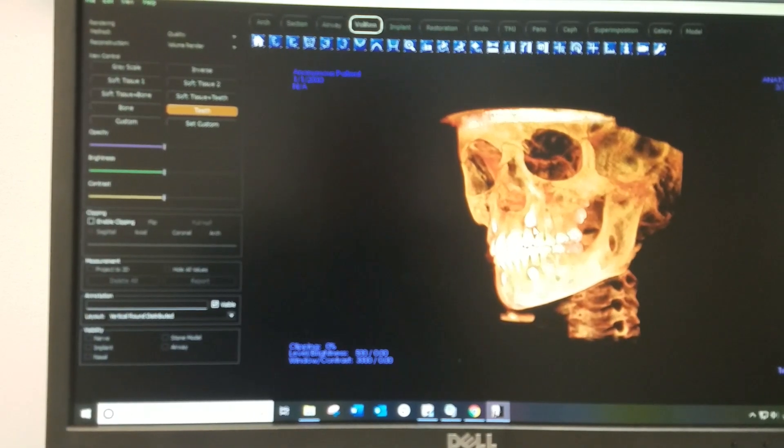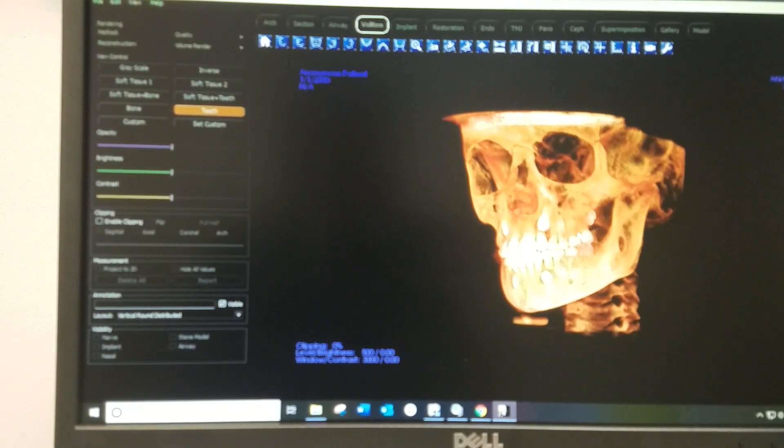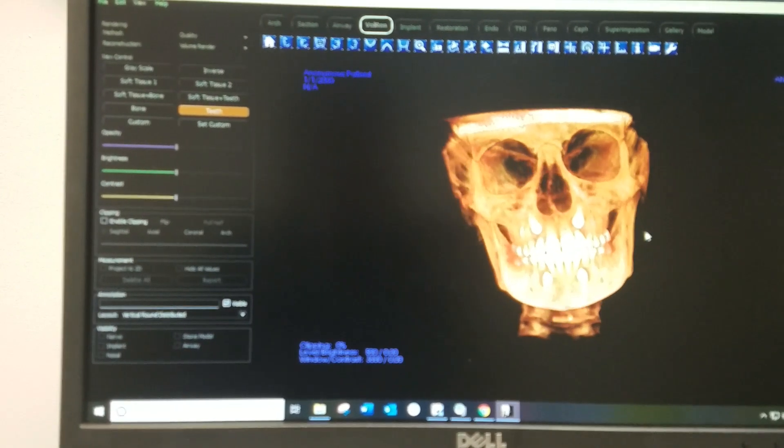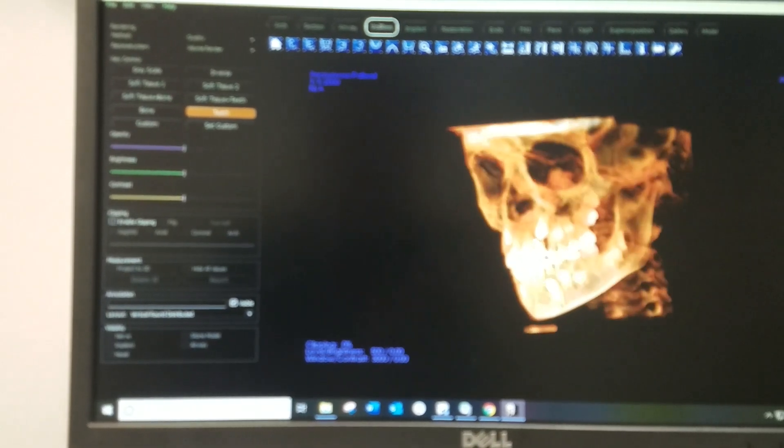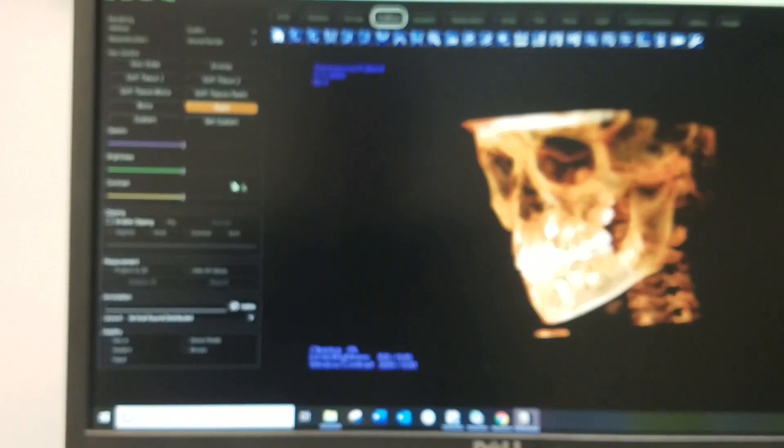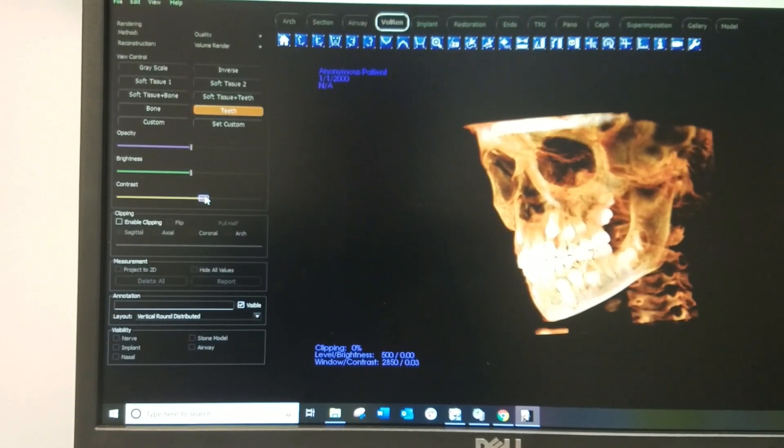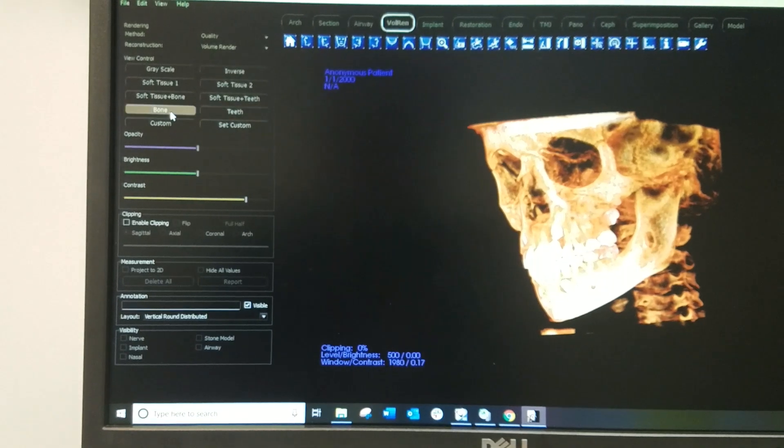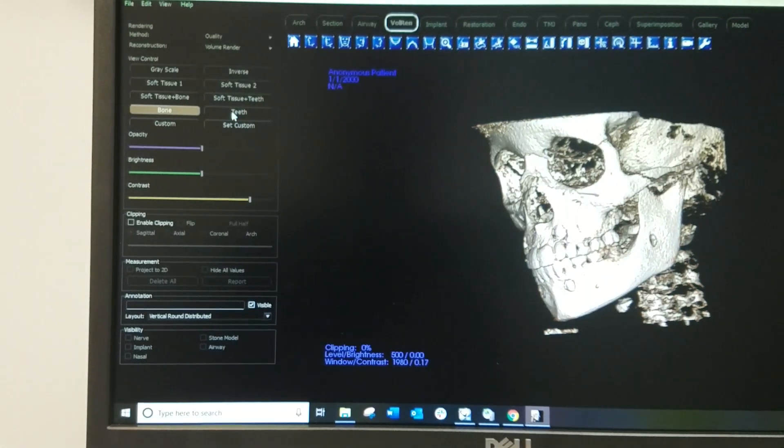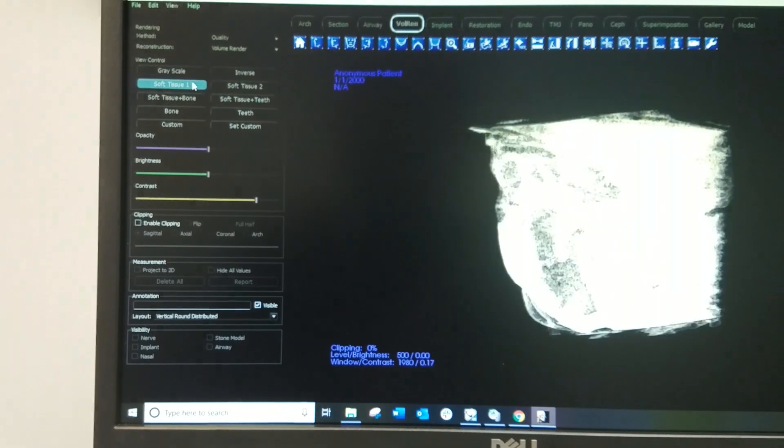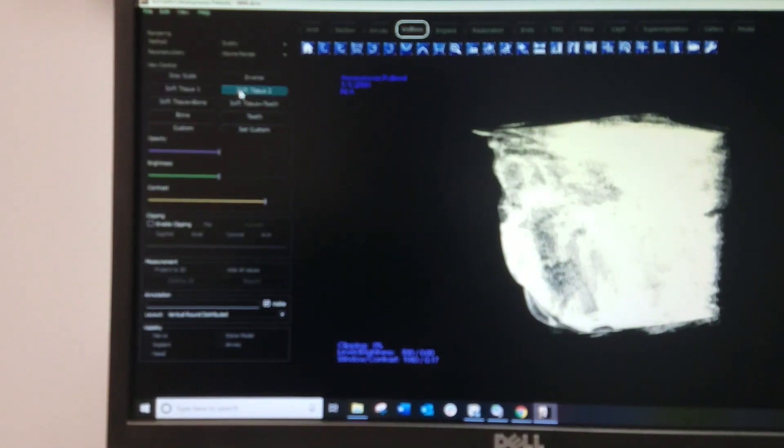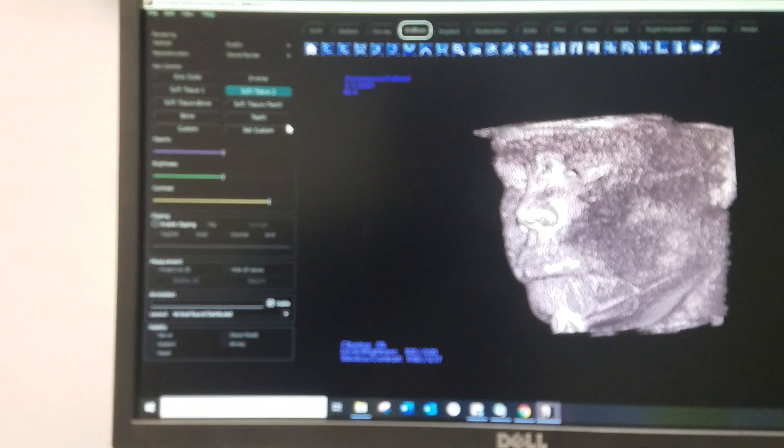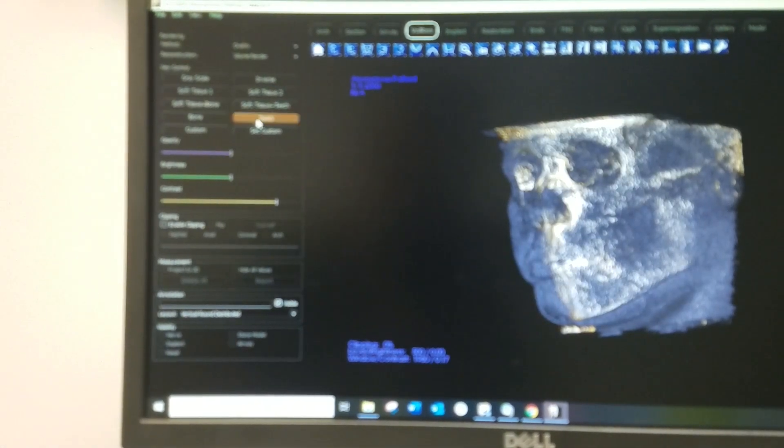Now this is the entire volume rendering of one of our patients that came in. You can see all these teeth and you can switch up the contrast. You can see it in detail, you can put the bone back on, you can see just the teeth. I mean, you can even put the soft tissue back on. You can kind of make out the image of the patient. It's incredible, really.